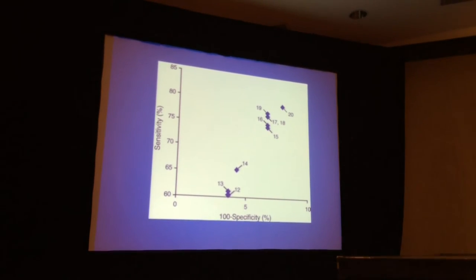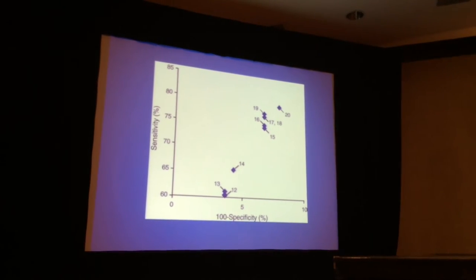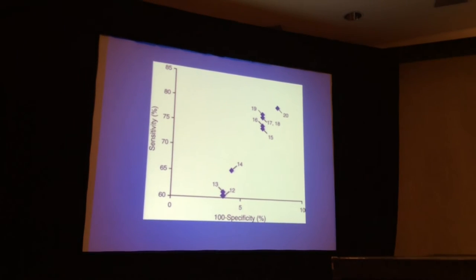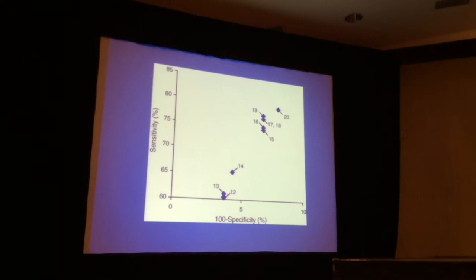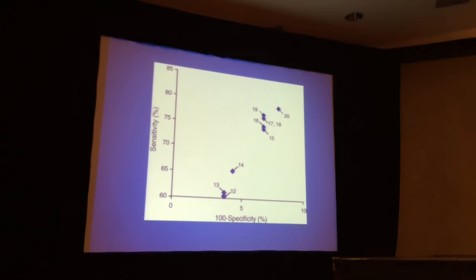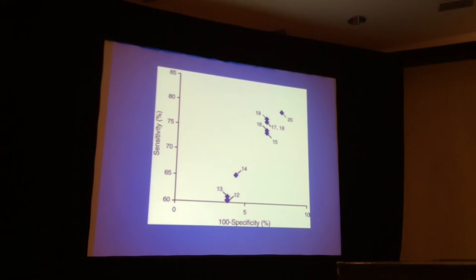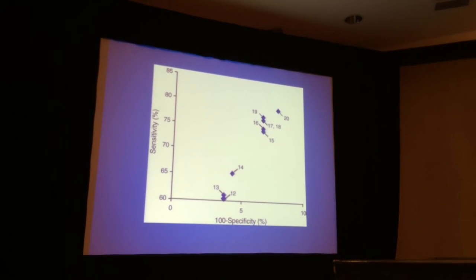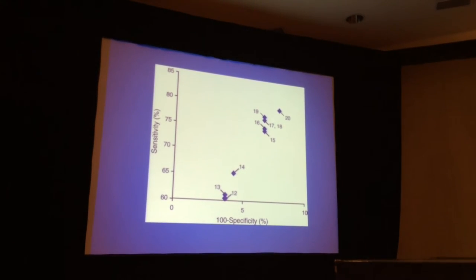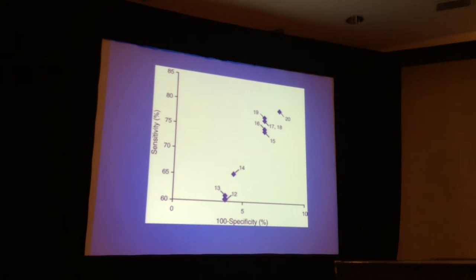The next question that Olle and I asked was, well, is there value in all 24 views? Or in fact, as you begin to add views, do you indeed fail to increase sensitivity and begin to decrease specificity? So we had patients that didn't have acute occlusion, so we had groups that were truly positive and truly negative. And what we found was, if you consider 12 leads, you have 4% false positives, and you have 60% sensitivity.